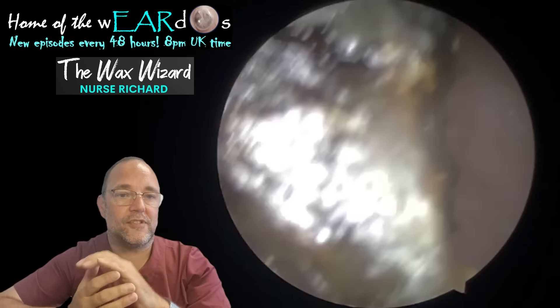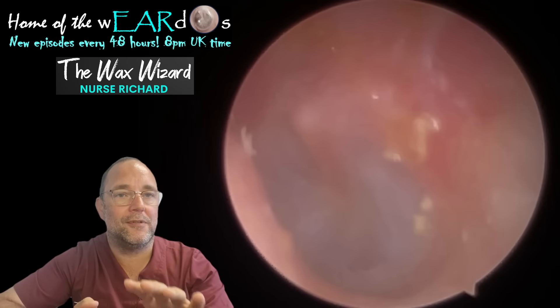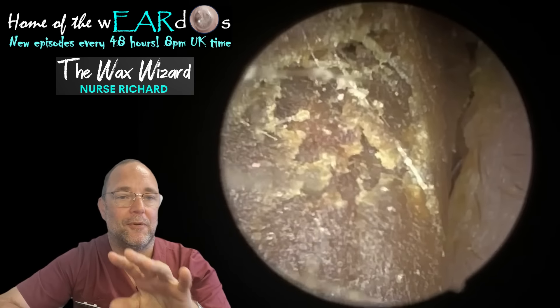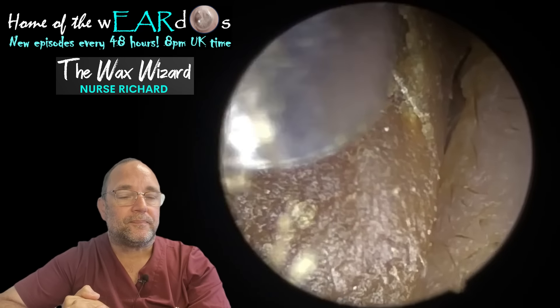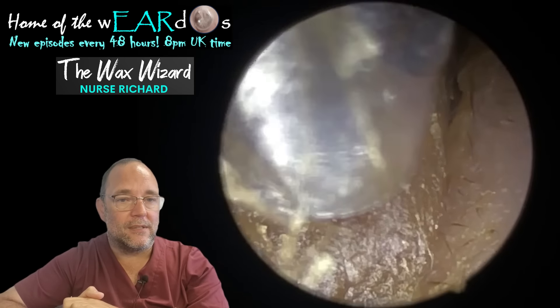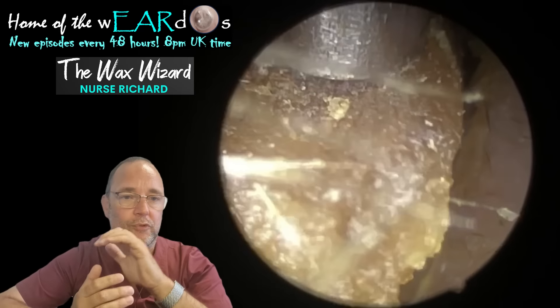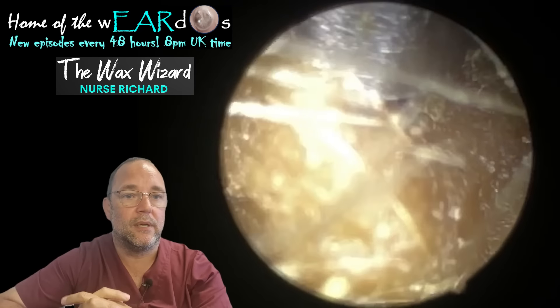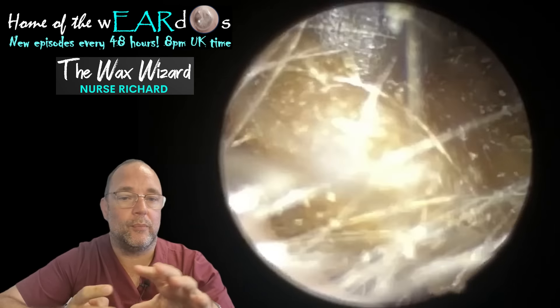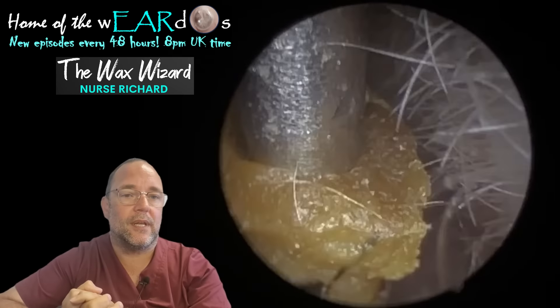Now, if you're a fan of seeing every little speck in ears removed, I suggest you stop now and do not watch the second one. I'm going to tell you why. Big old chunk, as you can see. But there were a few specks left — two or three specks, quite deep in the ear. Obviously I showed the patients on the screen what they look like. After I'd removed it and we got to the end, which you'll see very shortly, I could see a couple of specks there.